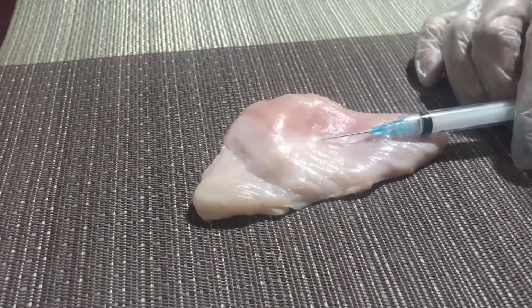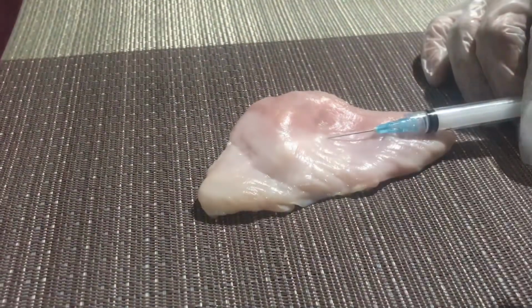So again, I will be applying a cotton ball while I'm withdrawing the syringe. So I will be placing this one back on the tray.